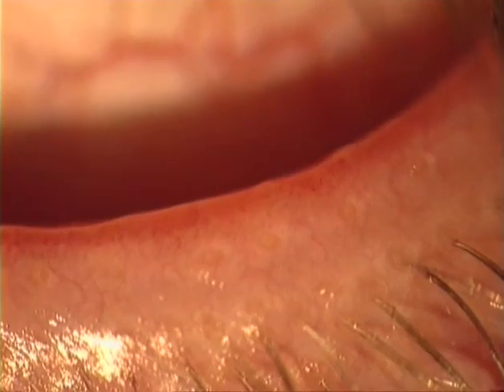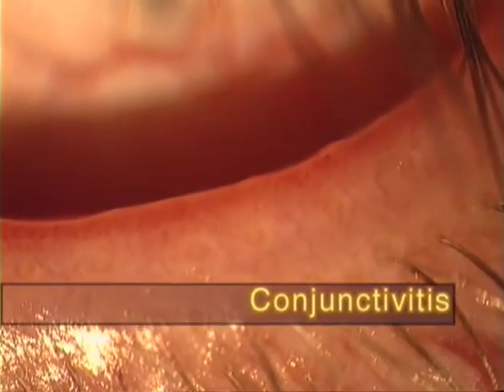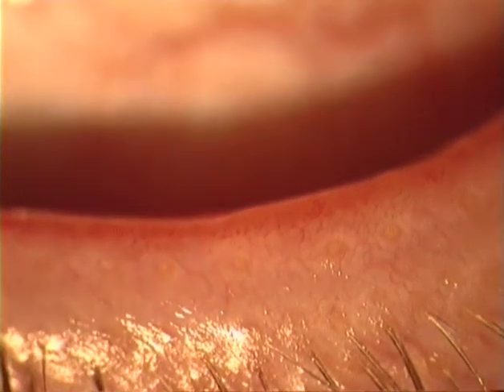The hyperemia at the lid margin may be restricted to the conjunctival rim only, if the inflammation is confined to the conjunctiva.